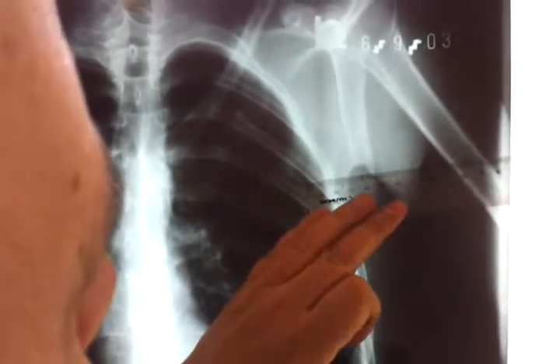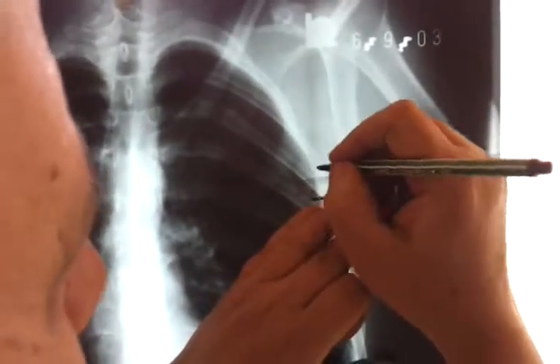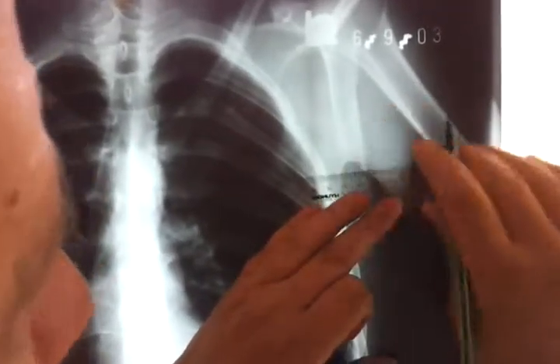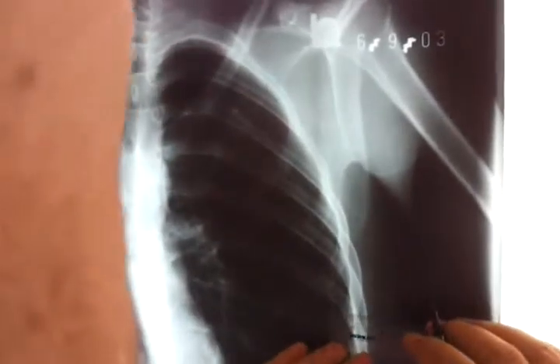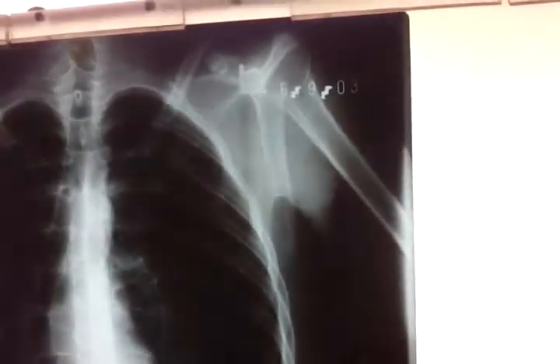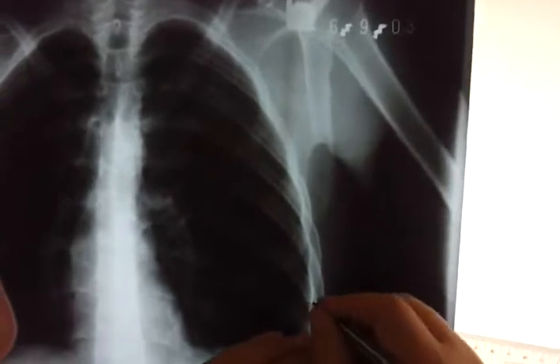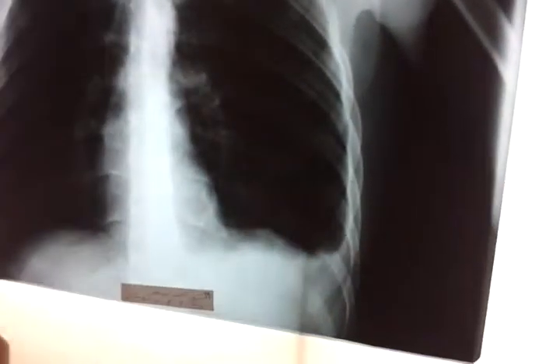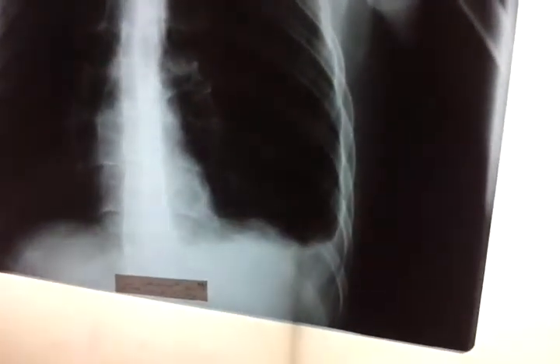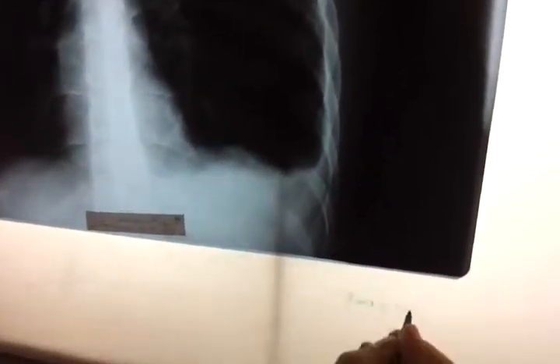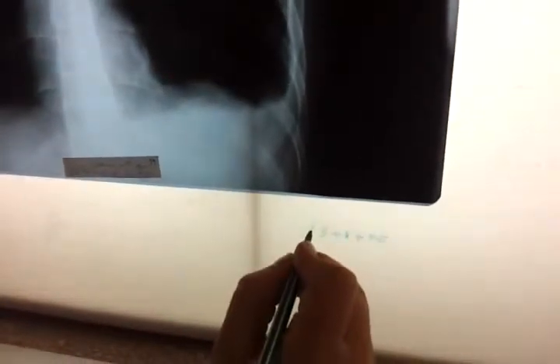One centimeter here, one centimeter there, and half a centimeter for the third part — so that totals approximately two point five, representing the percentage of pneumothorax.